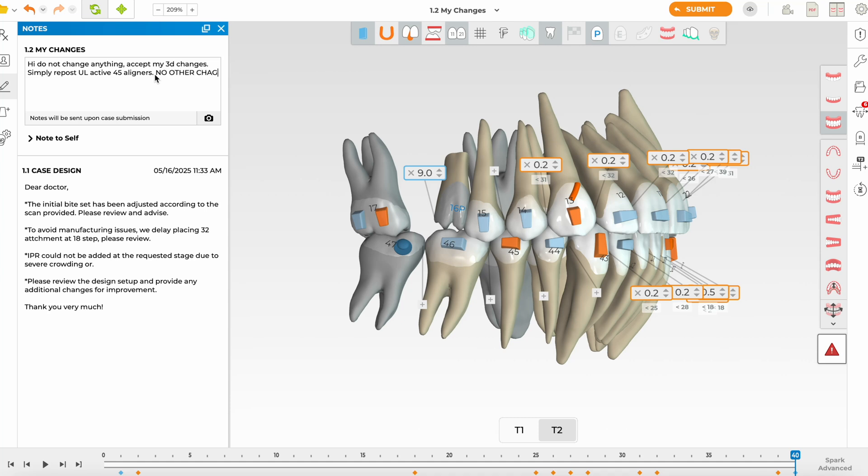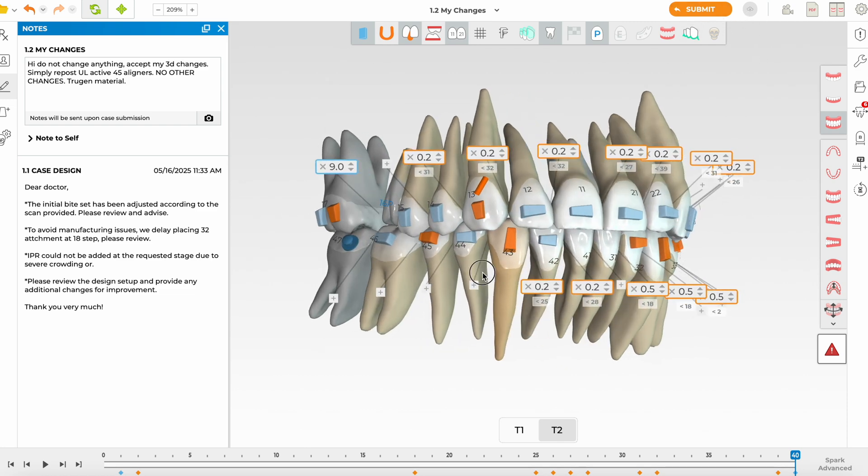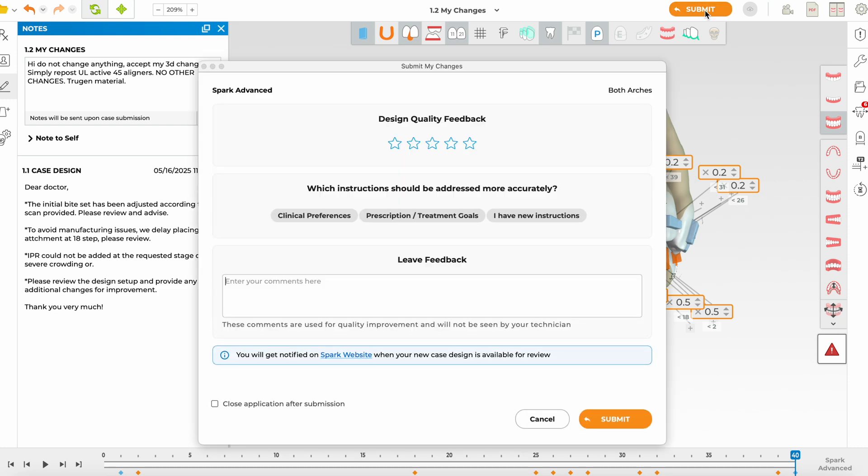I'm very particular to specify the material — make sure the True Gen material box is ticked. I absolutely love the Spark True Gen material for its flexibility, and I believe it places torque well and performs much better than Invisalign. I don't like the True Gen XR — it's too rigid, almost like a retainer material. I've uploaded this, I'm happy with the plan, and we'll submit. I hope you enjoyed watching this video — thank you.